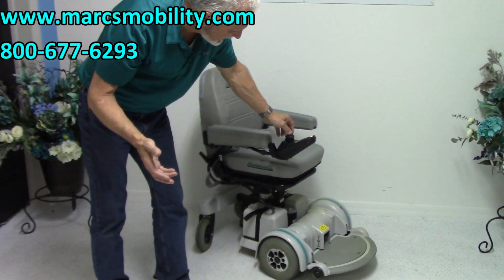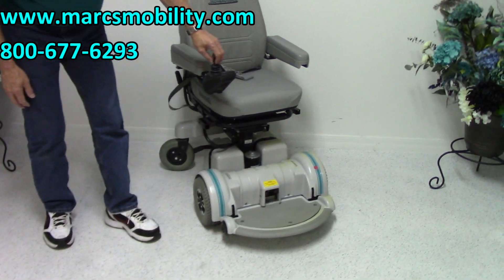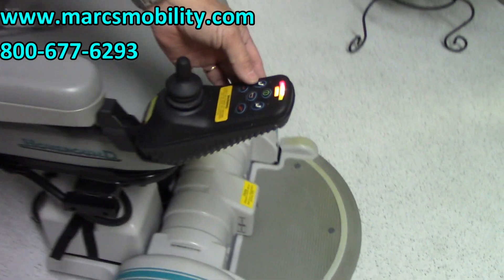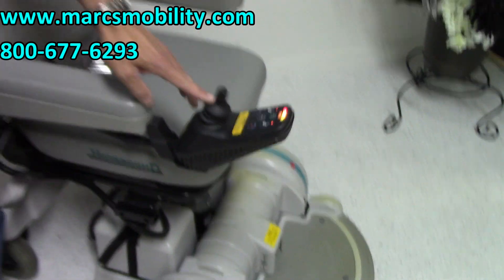You can see the seat lift motors right here between the two batteries. If you want to make the seat lift go up on this power chair, you go to the seat lift buttons, push the buttons up, and then use your joystick to make the seat go up.